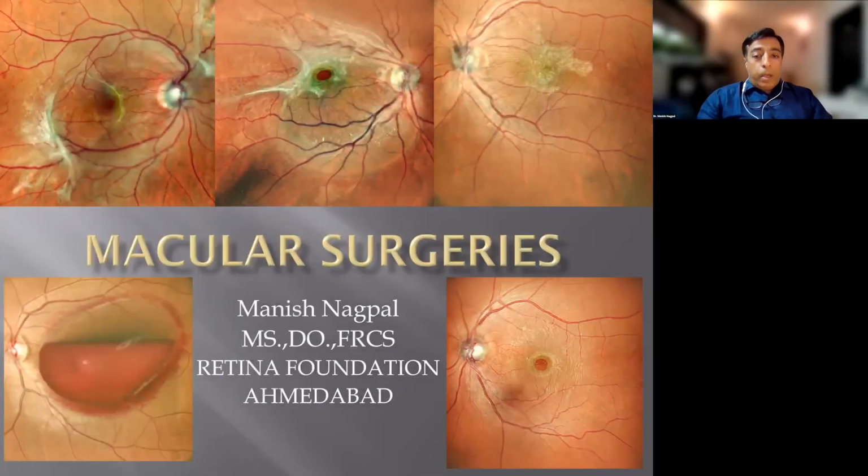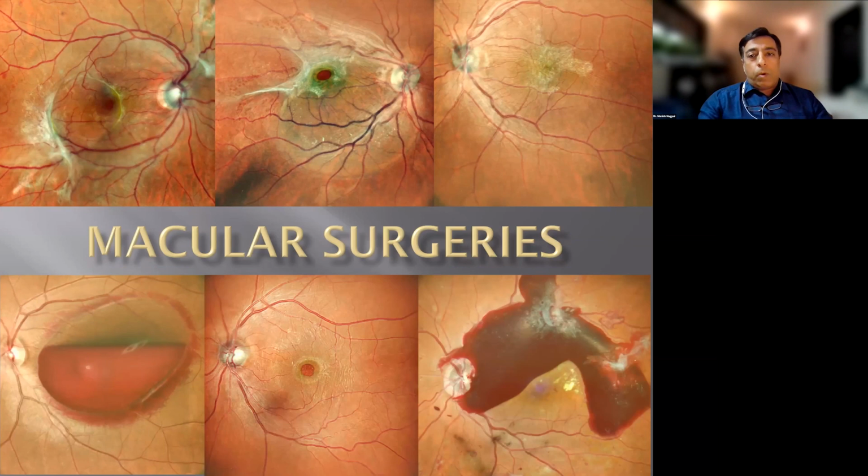So today we'll be discussing macular surgeries, and over the talk I would take you through a brief on the diagnostics, then the small incision surgery, and then go on to various macular surgeries. The most common being macular hole, then epiretinal membrane, subhyaloid hemorrhages, VMTs, and so on and so forth, and I would take you through some surgical steps that we do for various presentations with each of them.